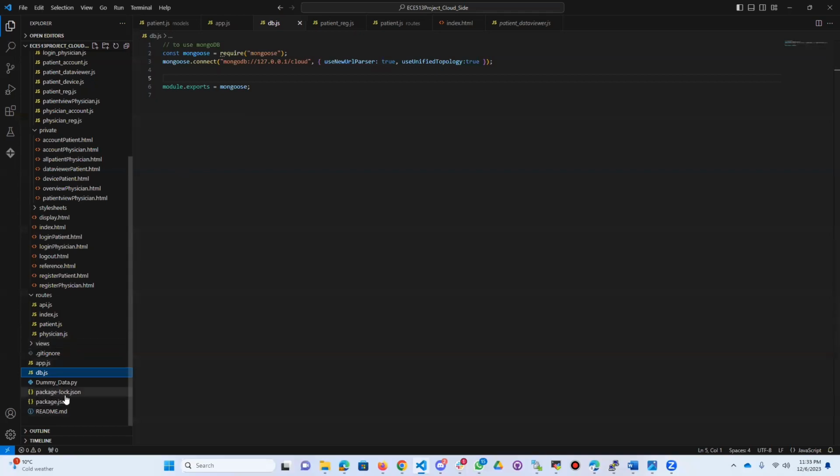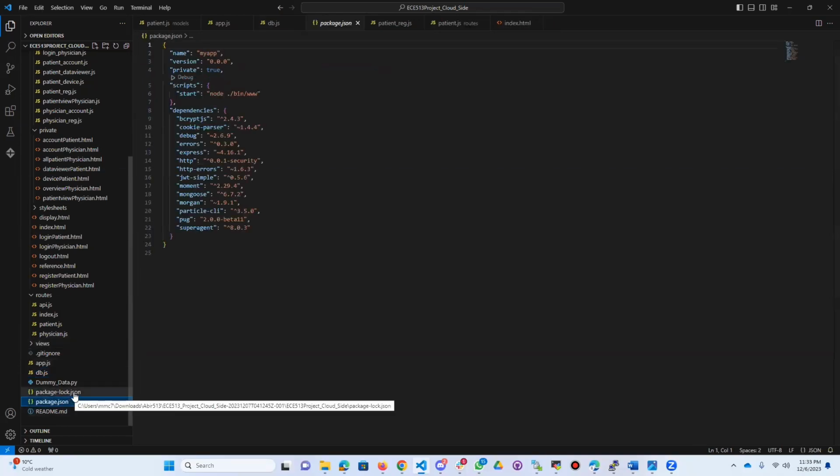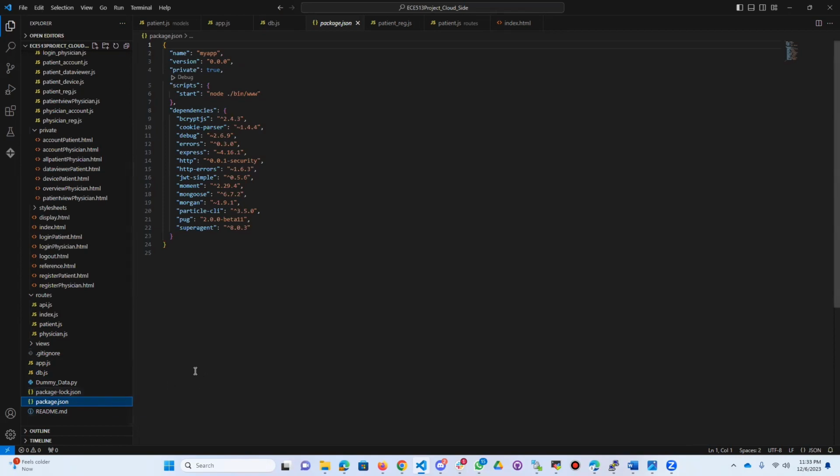And then the package.json and package-lock.json files. package.json is a configuration file that contains the metadata about our Node.js project, including its dependencies. And the other file is an automatically generated file that ensures consistent dependency versions by locking them down based on the specific versions installed during project setup. In this case, this is our whole project setup.